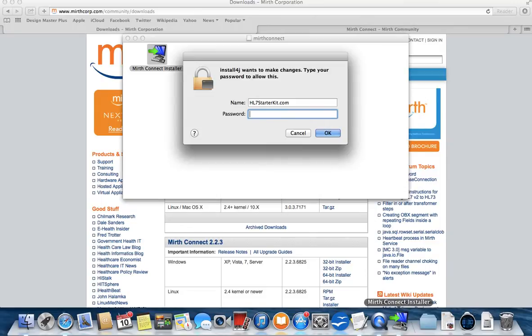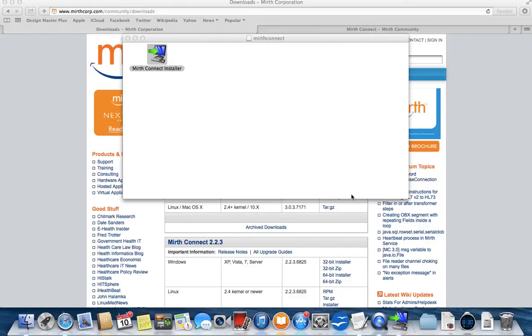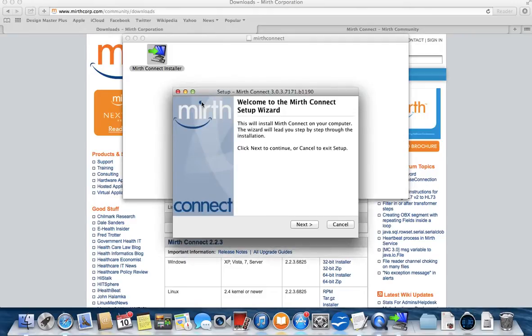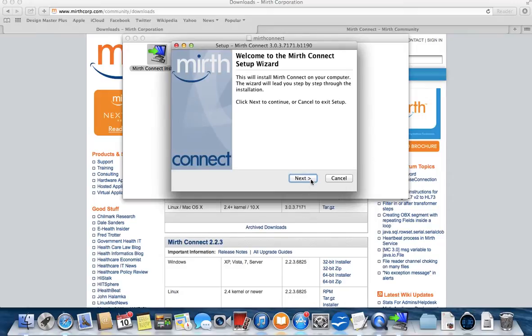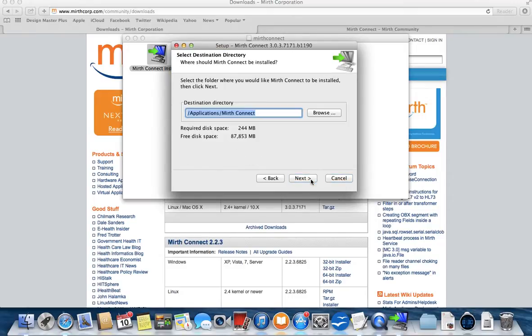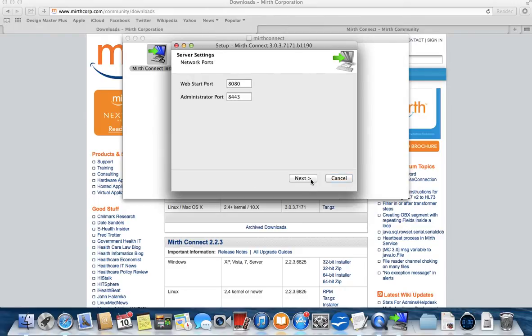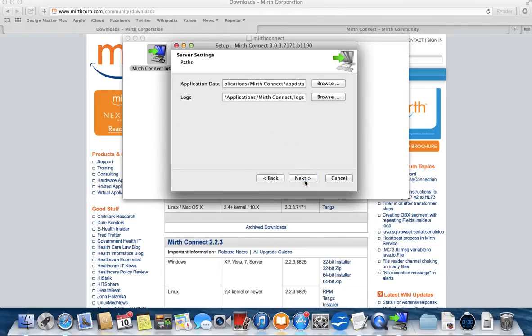Okay, here we go. It says you want to install Mirth Connect? I need your password, please. Enter your Mac OS user login password, the password to log into the computer. There we go. What I do is I accept all defaults. You can always change the defaults later in the administrator window. I just say next, next, next. Remember this port? It's always by default 8080. You can change that now or later.